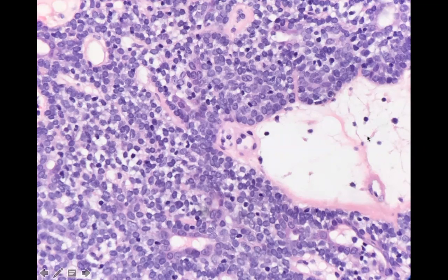And then this, it's all spread out here because there's a lot of edema and blood vessels. Here's all your little lymphocytes set inside it. Here's your little ductal structures, okay? Look for the little holes, the little ducts. These are not blood vessels. These are lined by the same epithelial lining, okay?